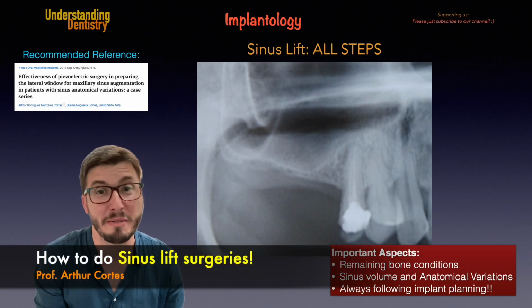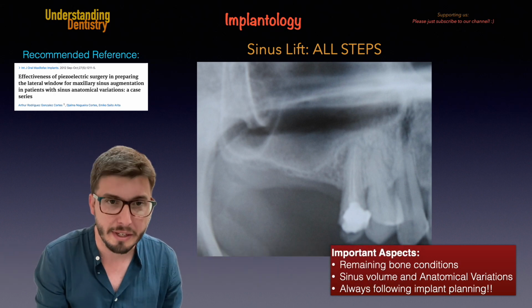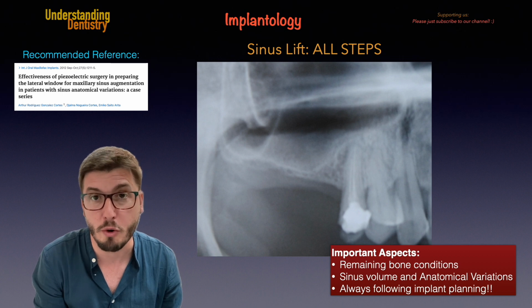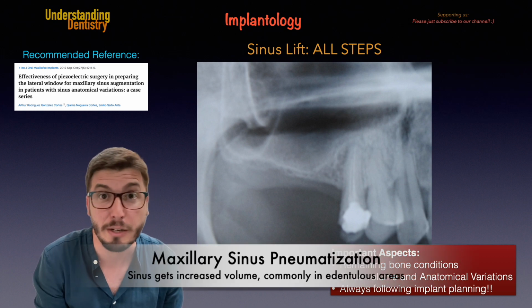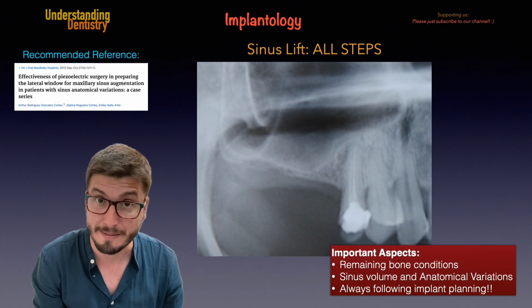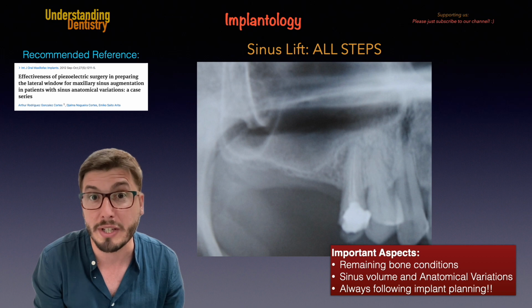Hello guys, and welcome to this video to learn all the steps of sinus floor augmentation or sinus lift, which is basically the sinus grafting procedure when we want to recover the bone height that was lost due to, of course, bone loss and sinus pneumatization. Those are two different events that happen, especially when we have edentulous areas.